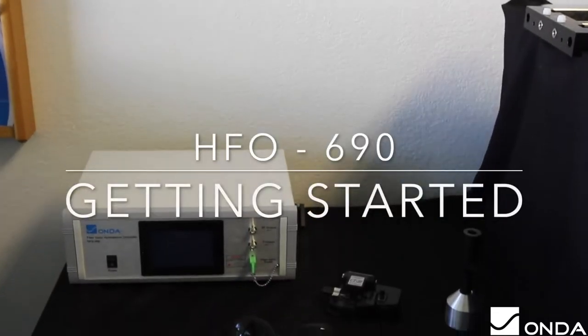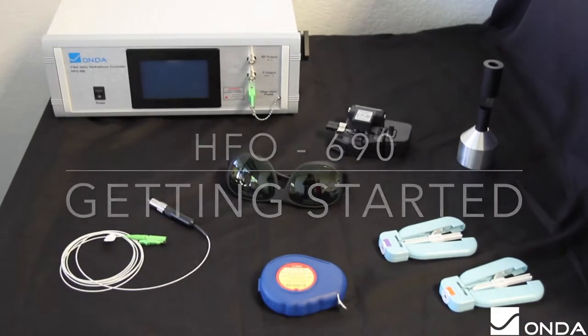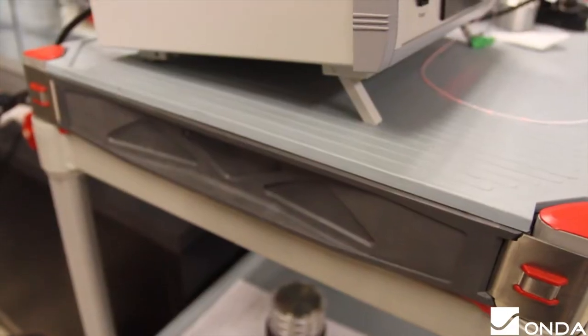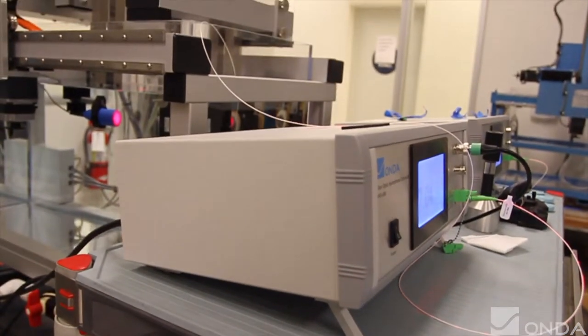The HFO 690 is the latest generation of fiber optic hydrophones designed for applications such as HIFU, providing both acoustic pressure and temperature measurements simultaneously. This video will walk you through the setup and calibration process.